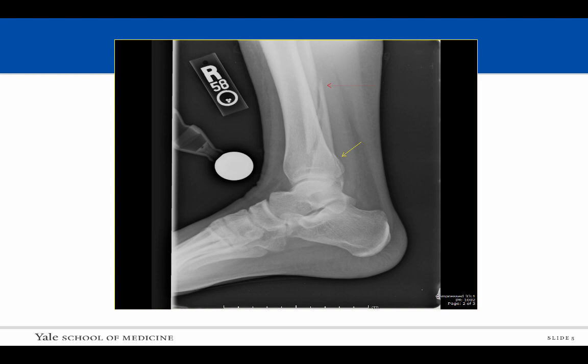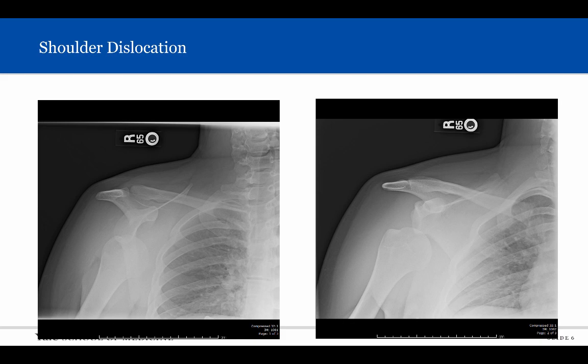This patient presented with shoulder pain and deformity. Internal and external radiographs were obtained, which are both in the frontal plane projection. The humeral head, seen in the pink circle, lies inferior to the glenoid, which is seen as the yellow circle.